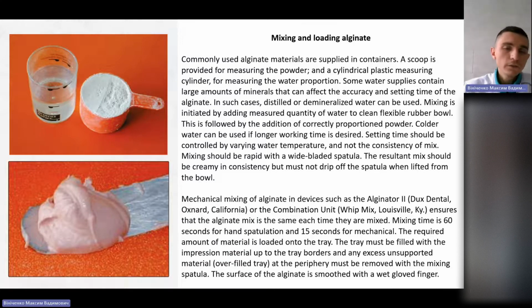If we talk about the theoretical part, it is right to make it this way. First of all, it is the water, and only then we add the powder. But usually we do the contrary. It's easier to make it another way, and to control the mixture.